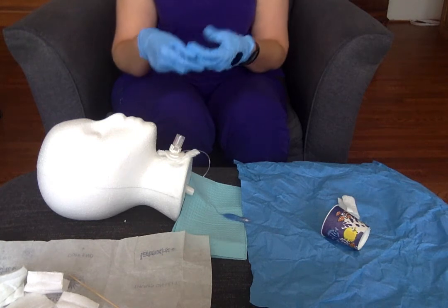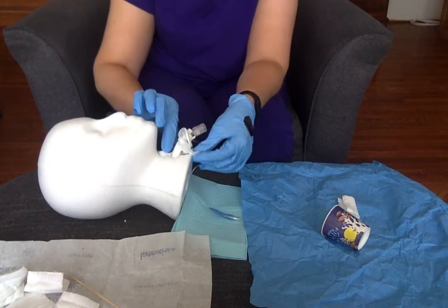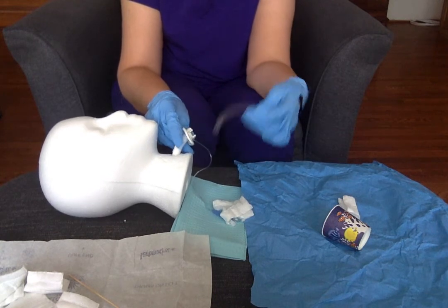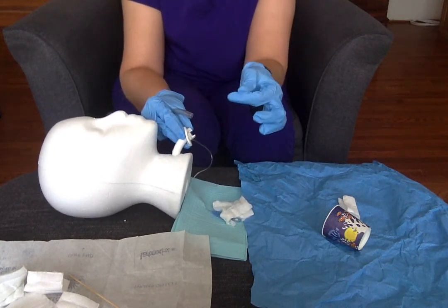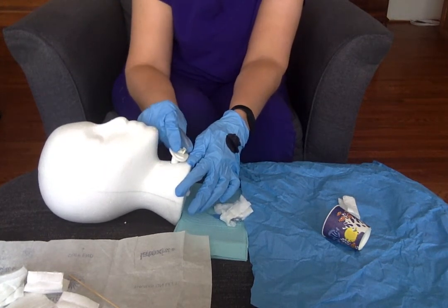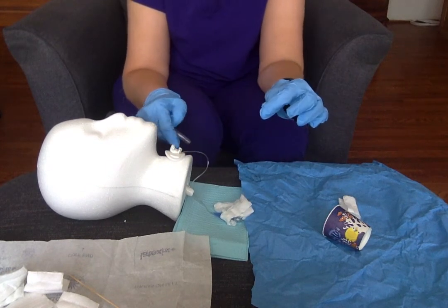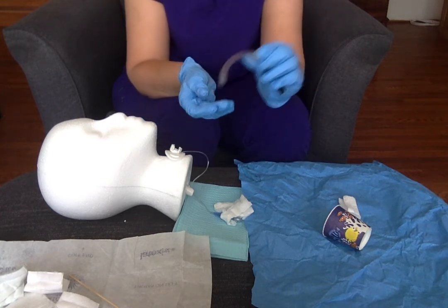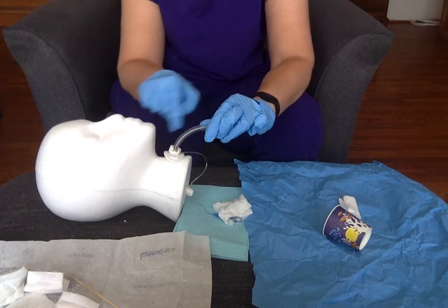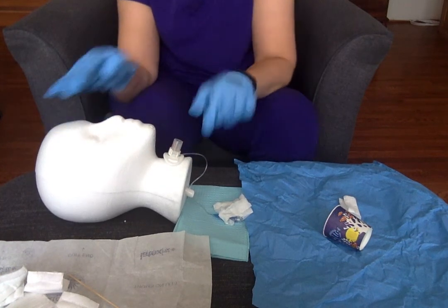For emergency purposes, we always keep an entire extra tracheostomy tube at the head of the bed — you should have the same size and one size smaller, that way you can get it in. If you had to put this in, there's a little obturator that goes in here instead of the inner cannula. You want to lubricate the end and then slide the whole thing into your patient. You have to pull that plastic obturator out because it's blocking the tube, and then put in your inner cannula. I can touch the end, but I want this part to stay sterile — pinch these little guys to clip it down. Don't just push really hard.